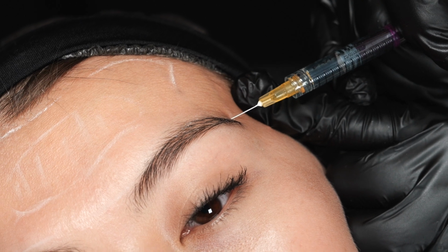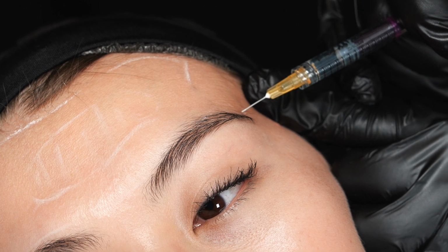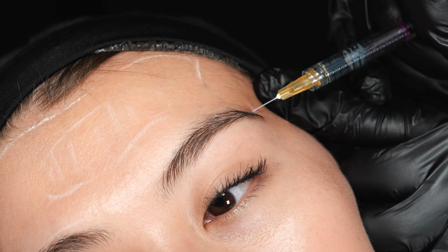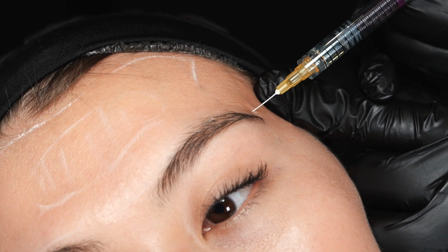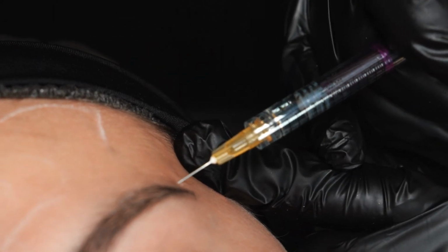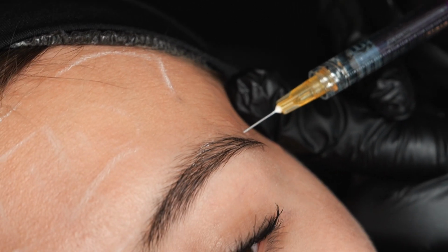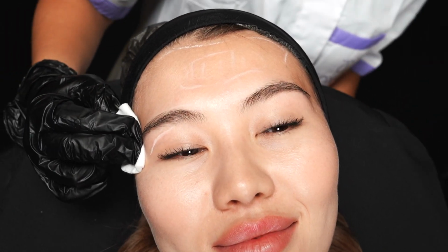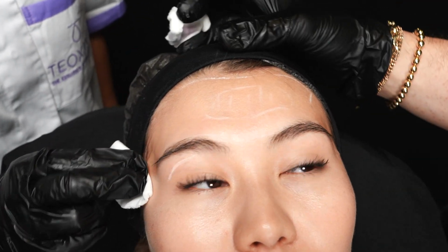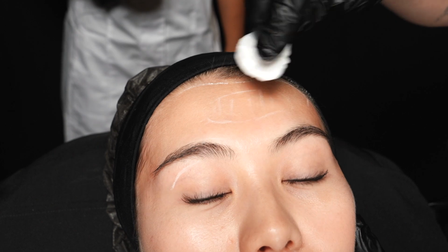Я не поменял иглу. После того, как вы коснулись надкостницы, лучше, если вы поменяете иглу, поскольку достаточно сложно пенетрировать кожу. Итак, считаю: 1, 2, 3, 4, и пациентка может испытывать боль. Простите, я не заменил иглу. Но обычно в своей практике я меняю, а сейчас я забыл. Извините, 1000 извинений. Итак, я ввел препарат в височную зону.